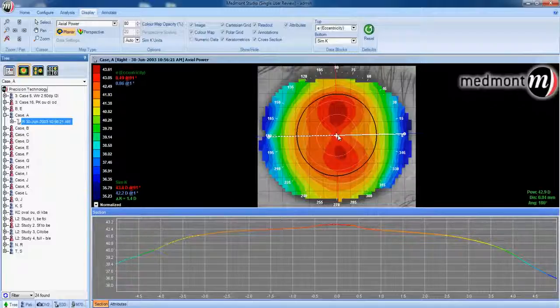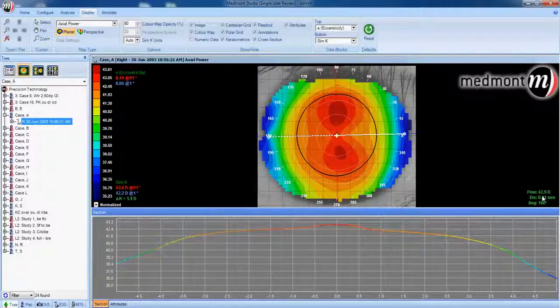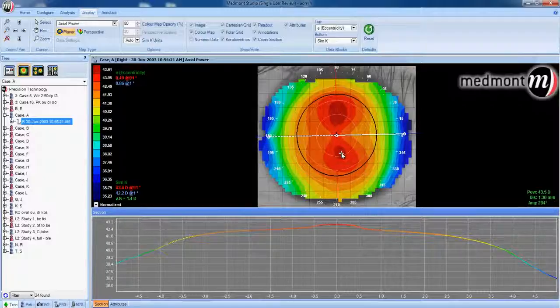Next, we could click our cursor in the center of the topography and determine the radius of curvature at that point — in this case, 42.9. We could click our cursor at any point on the map and determine the curvature at that point; in this case, 43.5, just inferior of the apex.